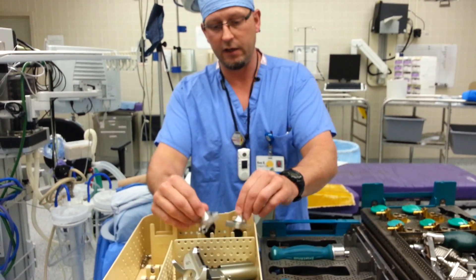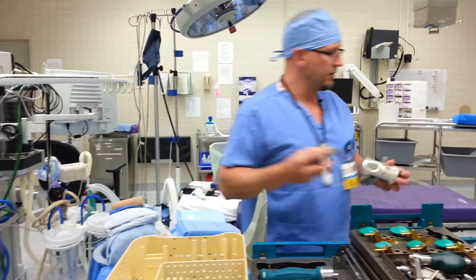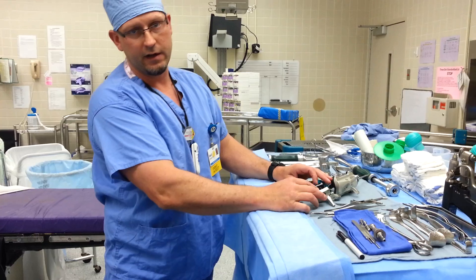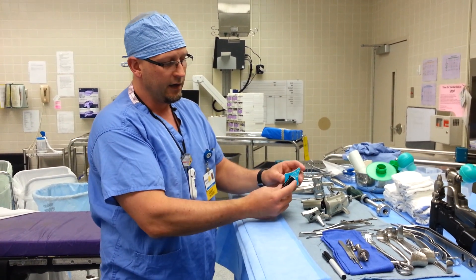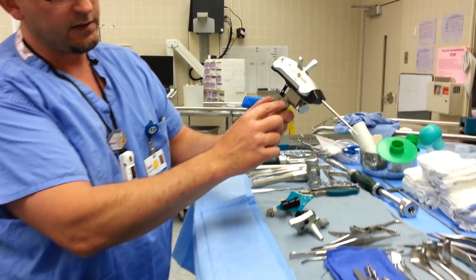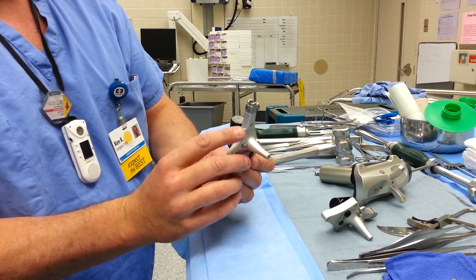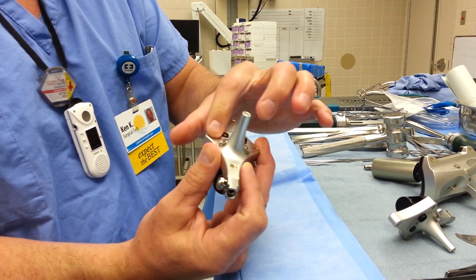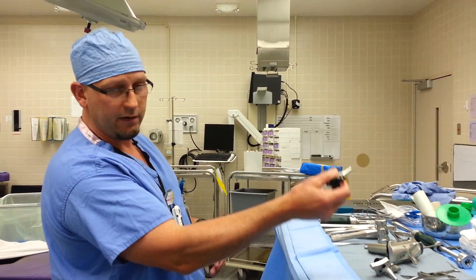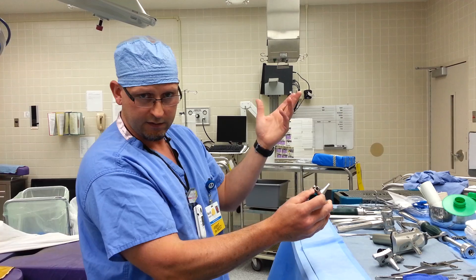Out of your navigation tray you're going to need two trackers — there's a blue and a green — and your pointer. You can put the batteries in them; you snap the batteries into each one of these trackers in these little spots, and it tells you on the side how to do it. Then push the button on the side and aim the tracker with these little windows towards the navigation machine. Wave it around while holding the button and it will ding, then a check mark on the screen confirms it's activated.